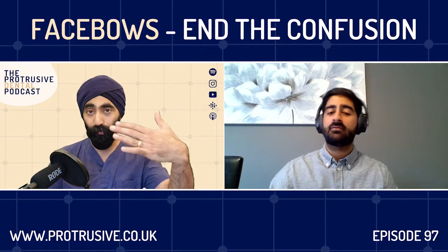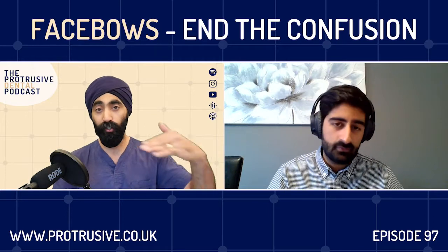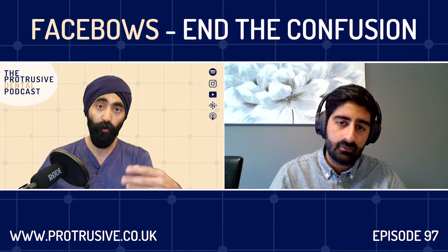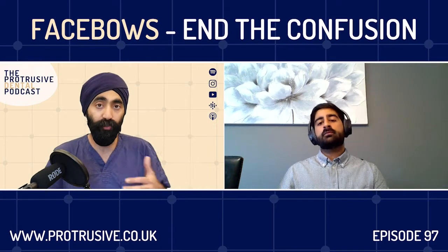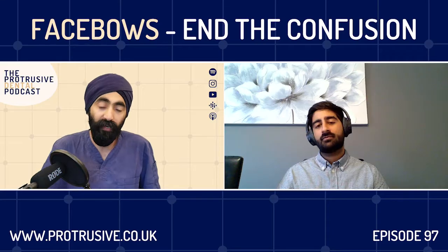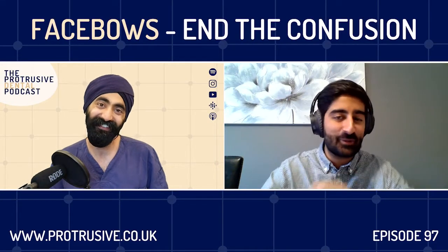So if you have a successful putty with the line going across, communicating the aesthetic plane, and the technician's able to mount that on an average value articulator without the use of the Facebow, and then you're getting good results, then therein lies the question: what additional benefits is the Facebow giving? Well, this is the big debate, right? Because there'll be things I say that people don't agree with.